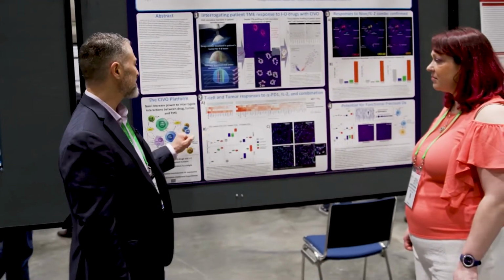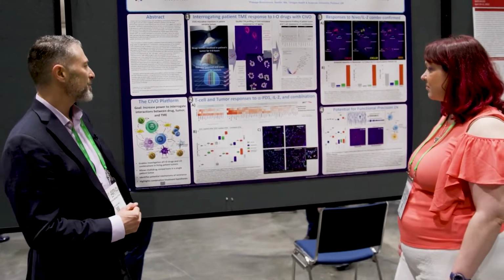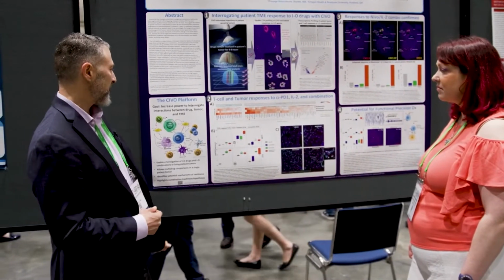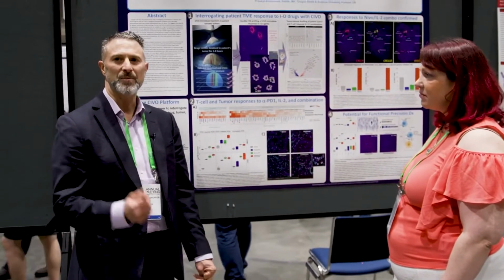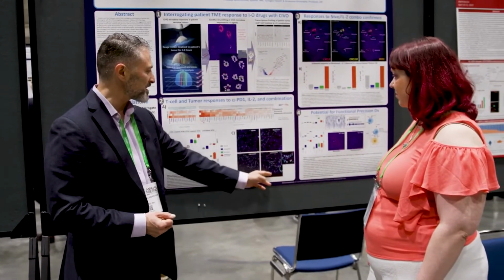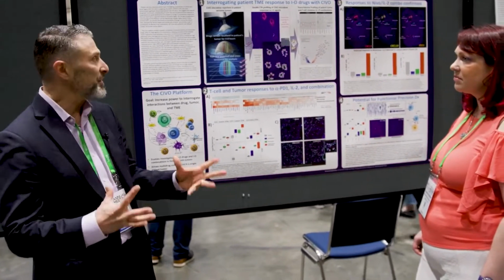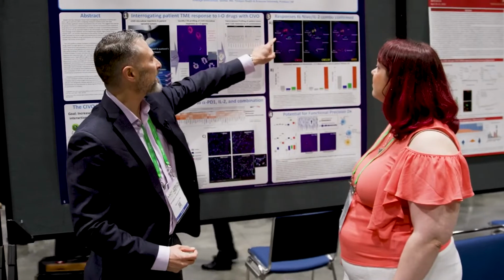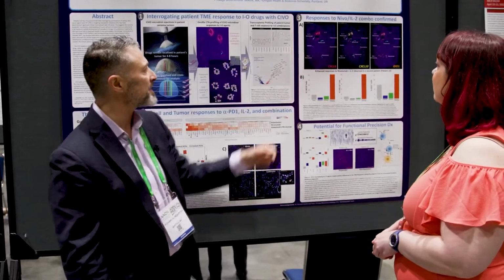So here again, we see just a glimpse of what we can capture with DSP. And we validate that in our own labs with our own immunohistochemistry. Here we could see elevation of granzyme B in the T cell population. And then we could do other things, for instance, go back and look at new tumors. So this is a completely different patient.